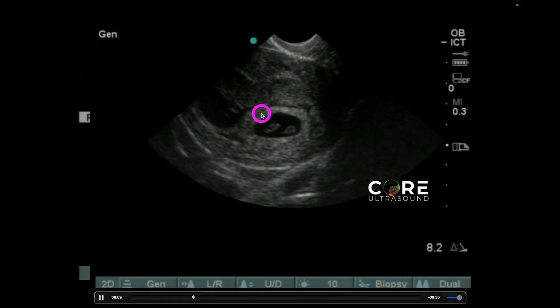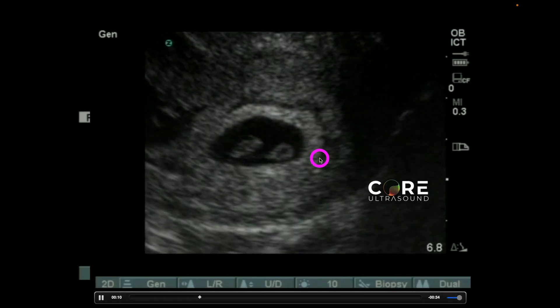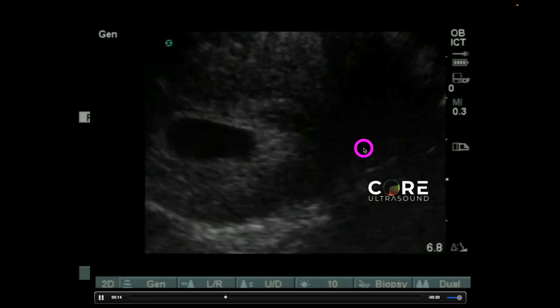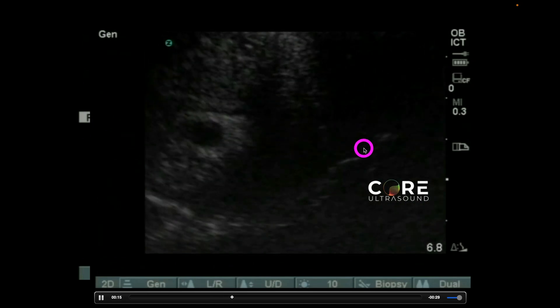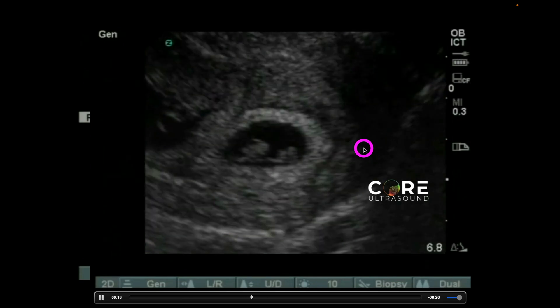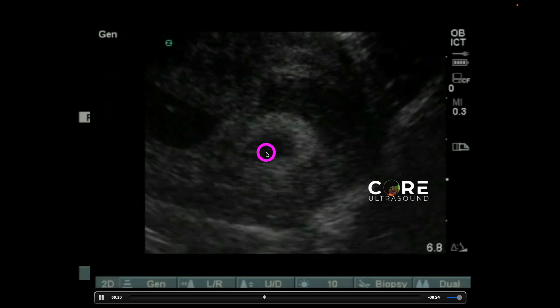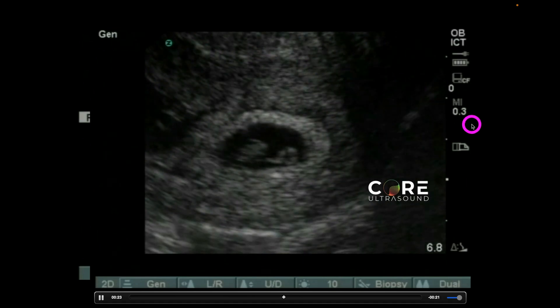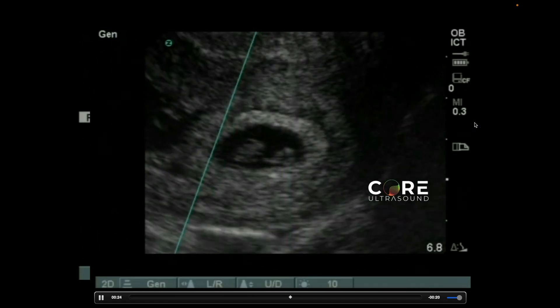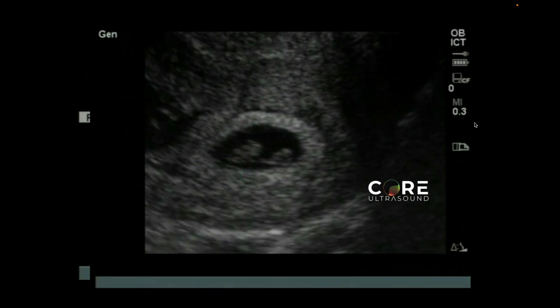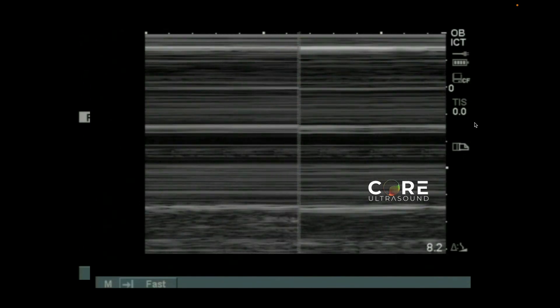First things first, identify that gestational sac with that fetal pole inside of it. Here, the practitioner zoomed in a bit just to get a good view, sweeping side by side and identifying that fetal pole right here. Next, you're going to want to hit that M-Mode button, move that cursor over to where you see that flickery heart, hit M-Mode again, and you'll get a waveform.